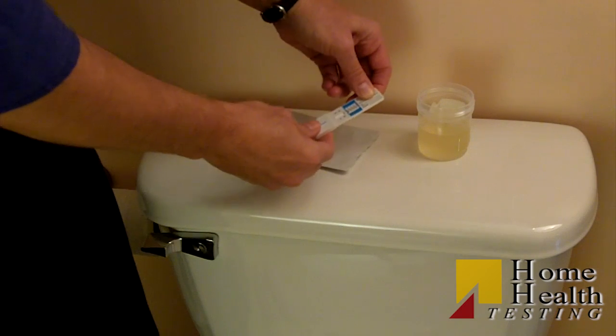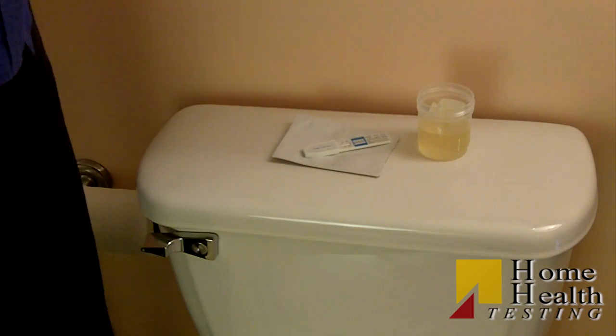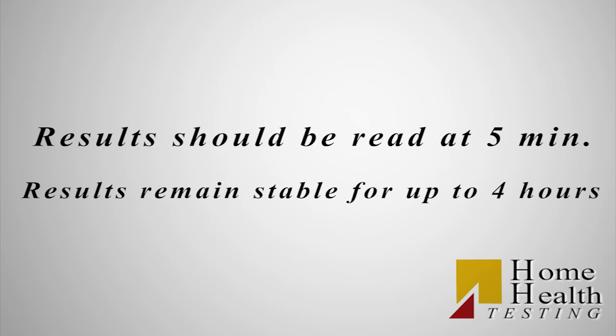Replace the cap and place the test card on a non-absorbent flat surface. Start the timer and wait for the colored lines to appear. The result should be read at 5 minutes. Results remain stable for up to four hours after the test initiation.